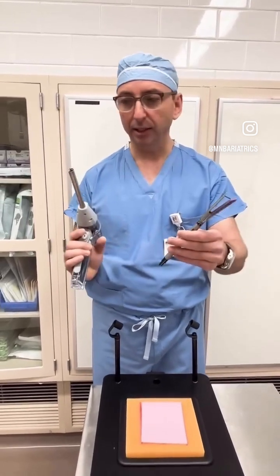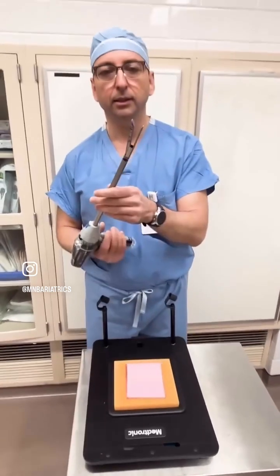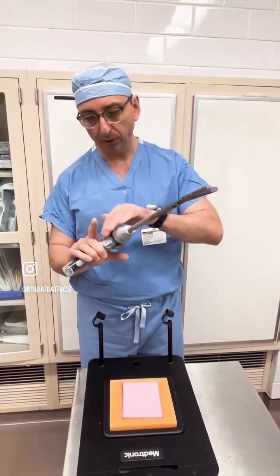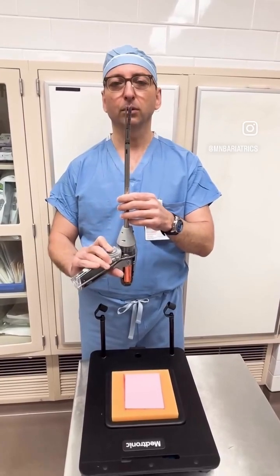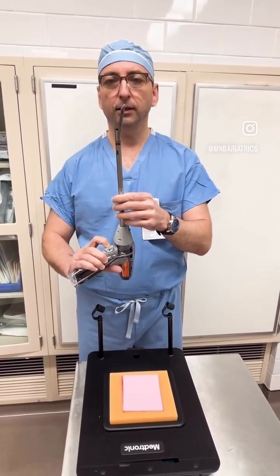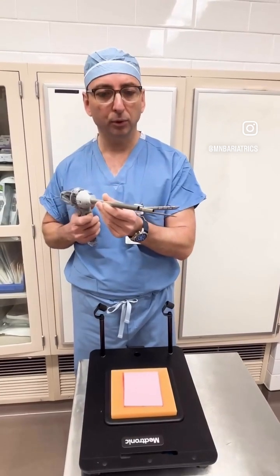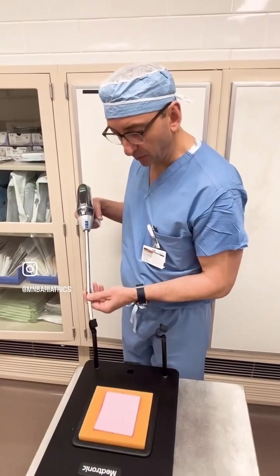It looks like this. It has two parts. You connect the two parts and the stapler now has all these buttons on the side, which I will demonstrate, that allow it to close, open, and articulate, depending on the position that we need in the bypass. Now I will show you how we do it when we staple.